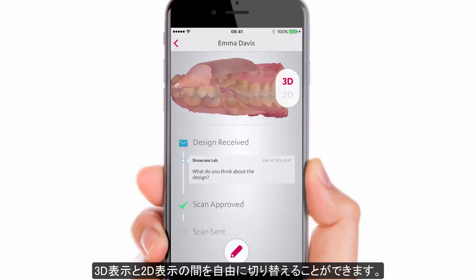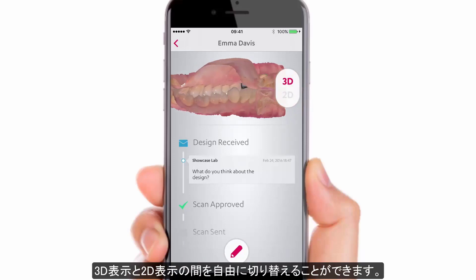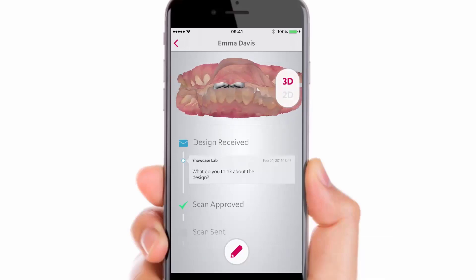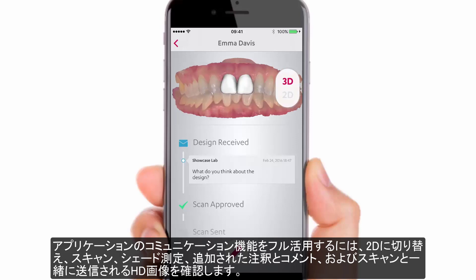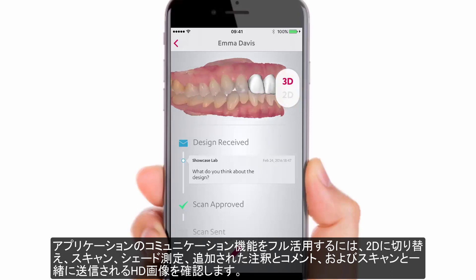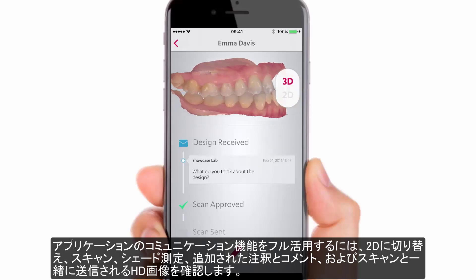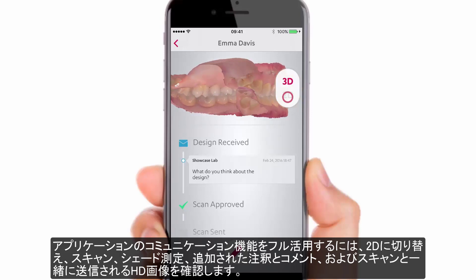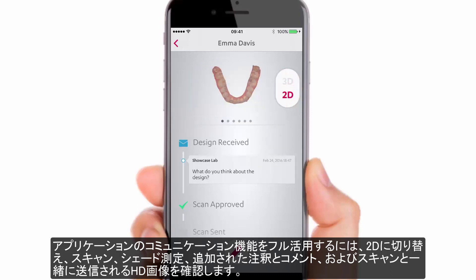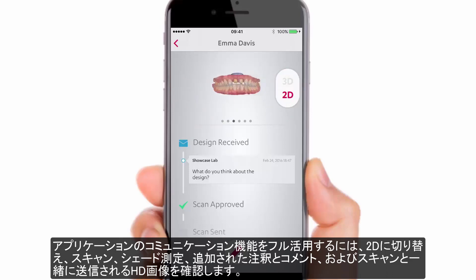You can freely change between 3D and 2D. To fully utilize the communication possibilities of the application, switch to 2D to see the scans, shade measurement, attached annotations and comments, and also HD photos sent with the scans.